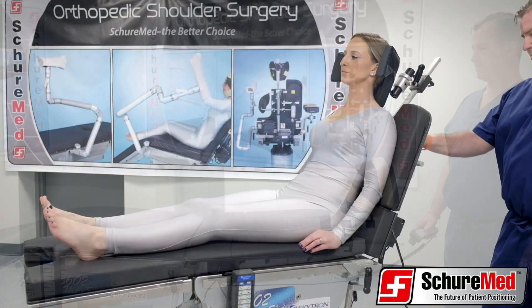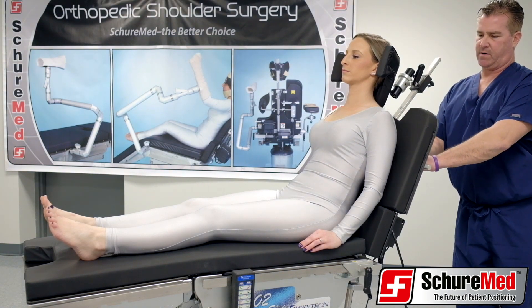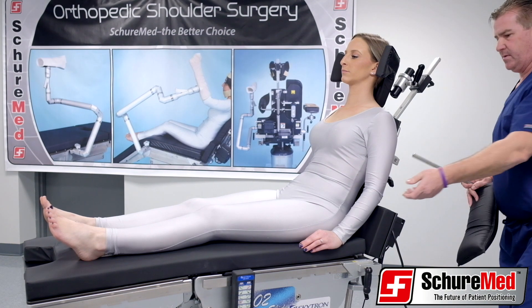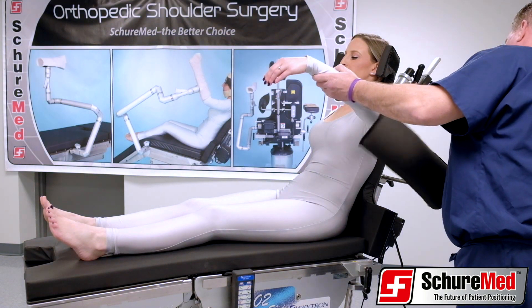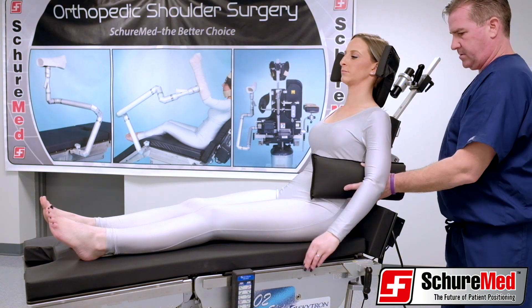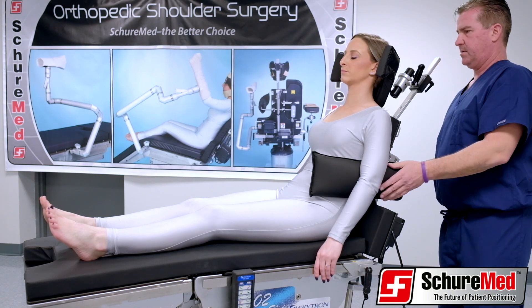Once the patient is positioned, turn the top and bottom panel latches down to unlocked positions. Hold the handle with one hand and lift the plunger up. Slide the shoulder panel straight back to remove. Slide the lateral brace into the exposed clamps and adjust to fit the patient. Lock tight by turning the locking handles to the right.